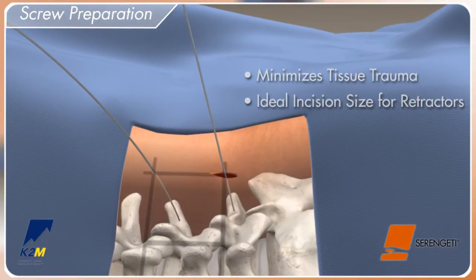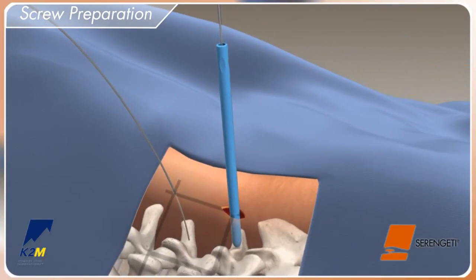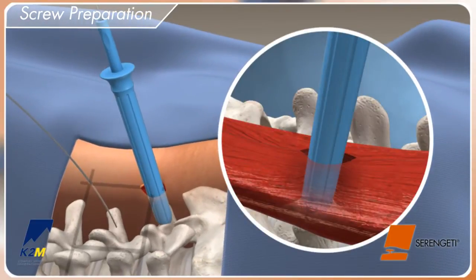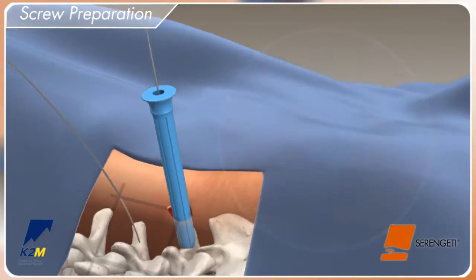In preparation for tapping the pedicle, place the inner dilator over the guide wire and advance through the muscle to the pedicle, ensuring a flush position with the bony anatomy. This is followed by the outer dilator. Remove the inner dilator while keeping downward pressure on the outer dilator.